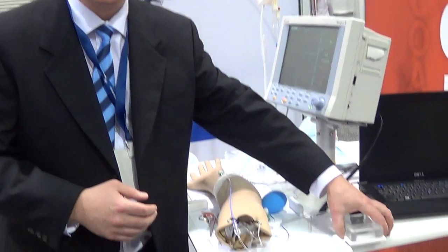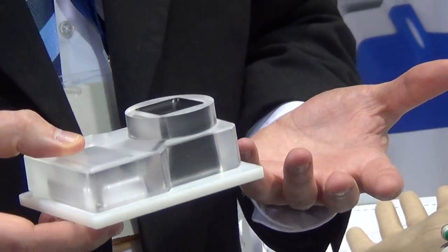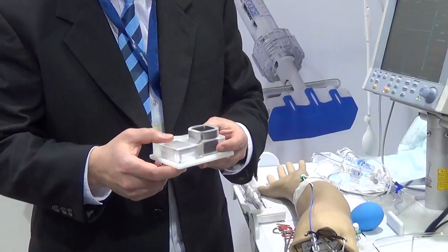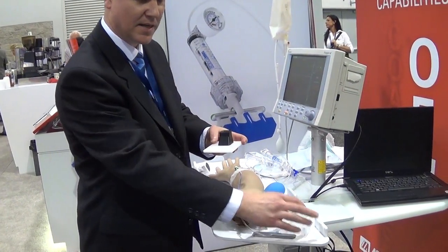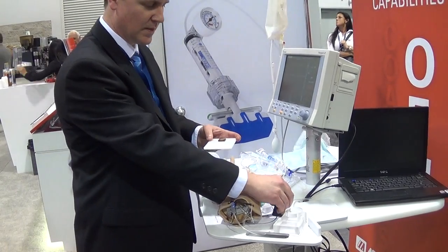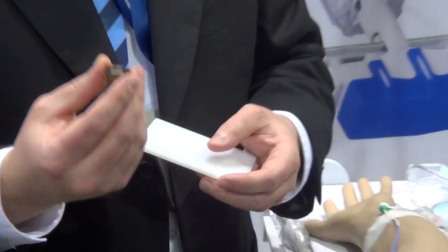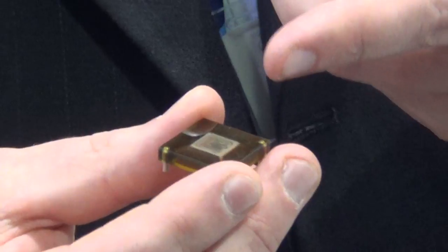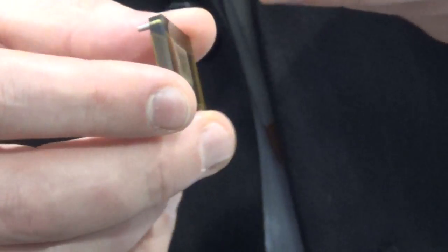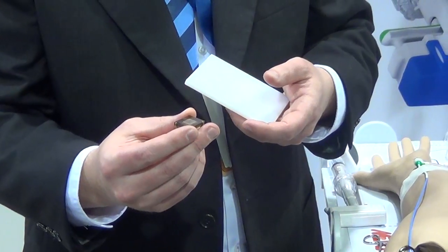First, a little discussion about the sensor. This is a scaled-up model of the pressure sensor that Merit Sensor manufactures. I'm going to take it apart so you can see how it's assembled. This is the brains of the sensor — this is the MEMS element.